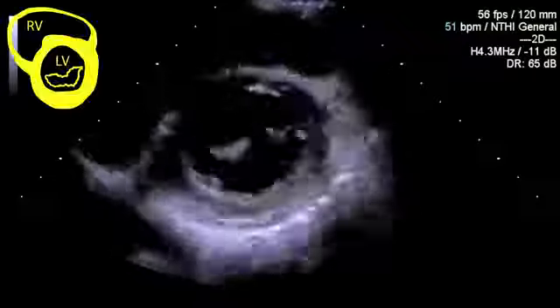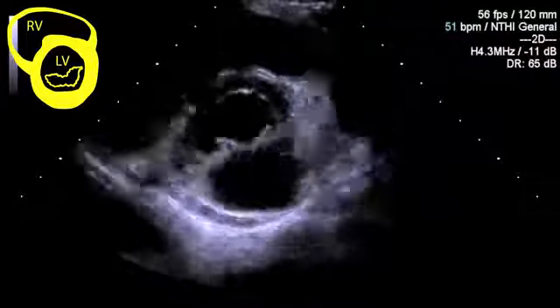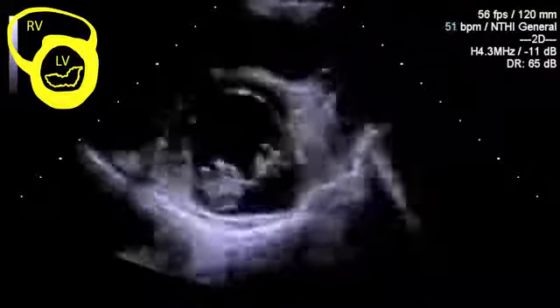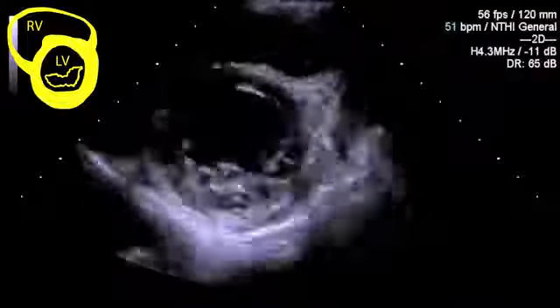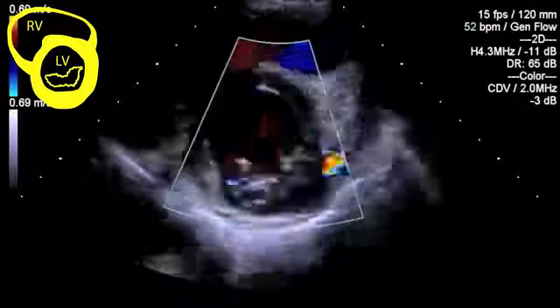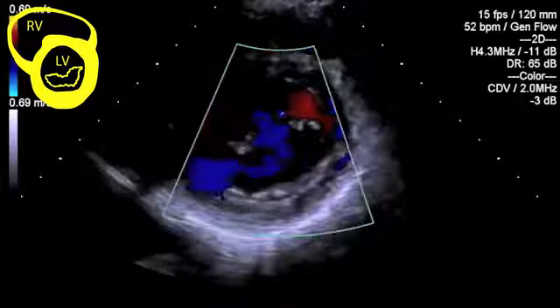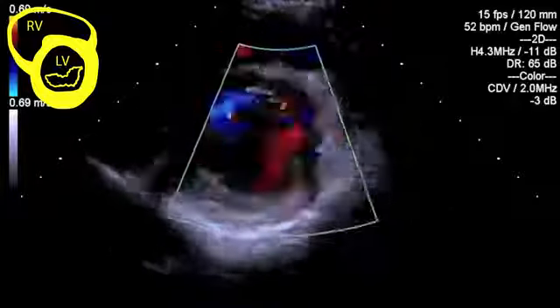Here you'll see the mitral valve on a short axis, where you can have a look at leaflet movements of both the anterior and the posterior mitral leaflet, and it's important to apply colour flow Doppler to make an assessment of any gross valvular regurgitation. Have a look at the left ventricular contractility and wall thickness, making any observation of regional wall motion abnormalities.